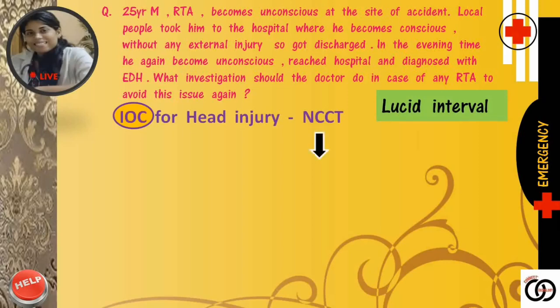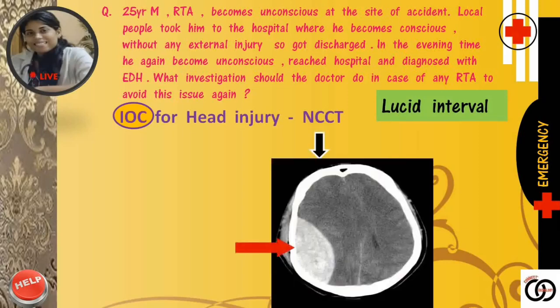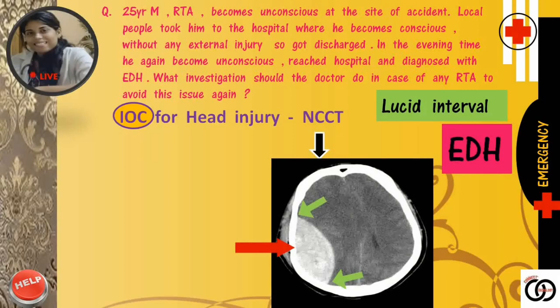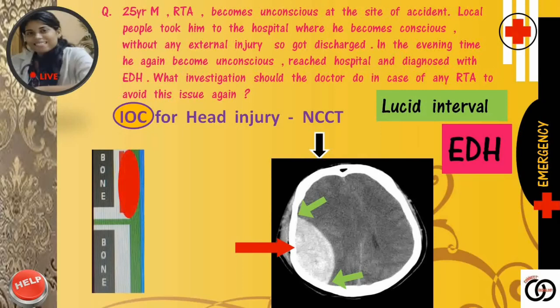Now see the scan of this patient. Can you appreciate a biconvex or lentiform-shaped hyperdense area? This is typical of epidural hemorrhage. See the bleed is limited by the coronal suture in the front and the lambdoid suture behind. But this bleed can cross the midline in the frontal area as there is no metopic suture in adults. Please remember, the lucid interval is common in EDH but is not exclusively found in EDH only. It's because of the rupture of the middle meningeal artery in the space between the bone and the endosteal layer of the dura mater.